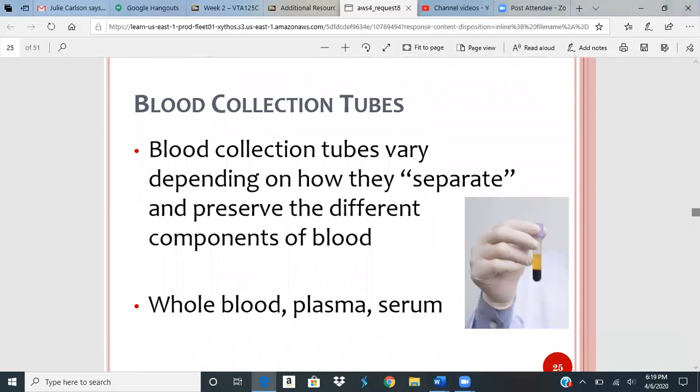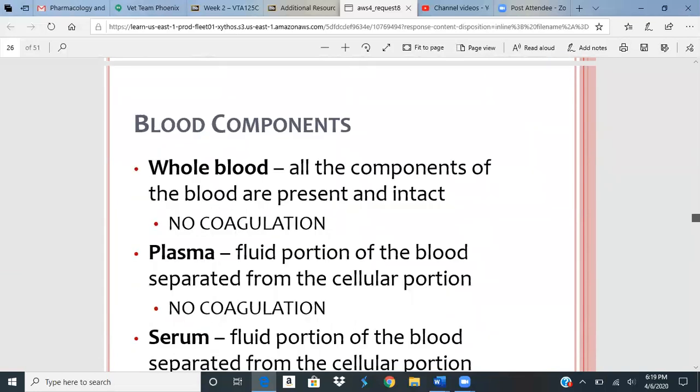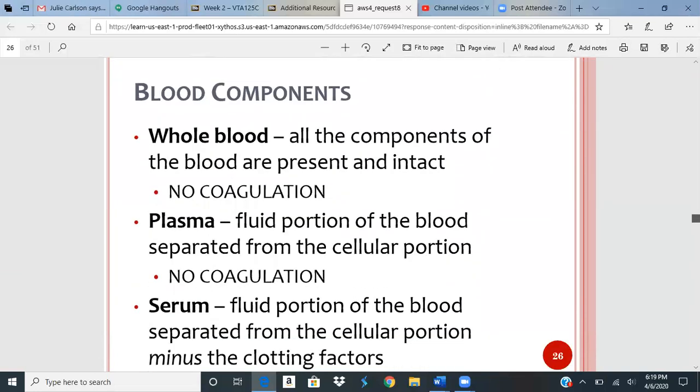It all varies based on what the tube does. There are tubes that will separate serum. There are ones that separate plasma. There are ones that will help the blood clot, help the blood not clot. All kind of depends on what it is we need. And then here's your components of blood. We're going to talk about that more tomorrow.